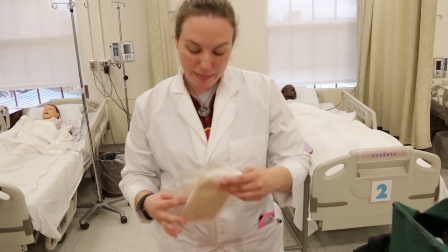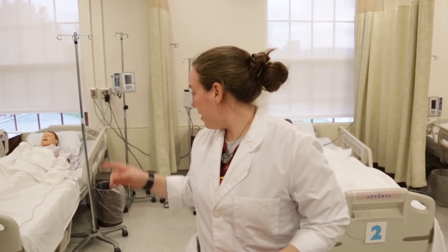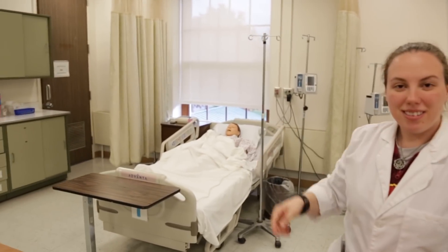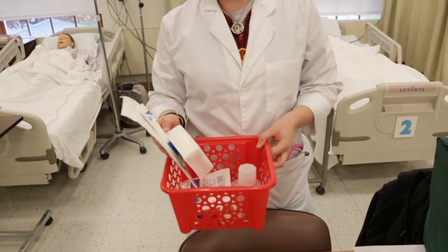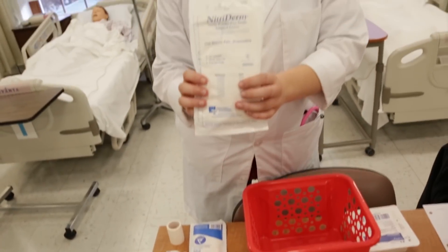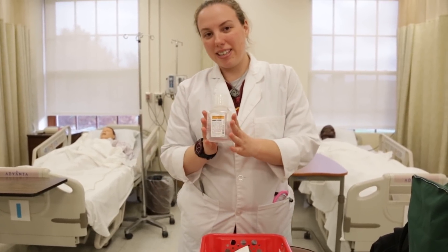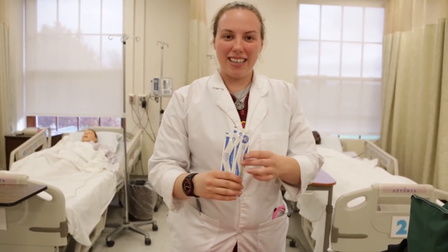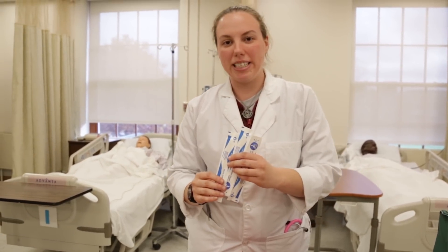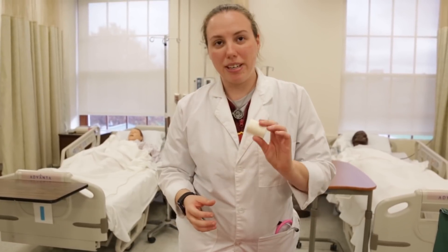I am combining all my dressing changes in order to change the wound dressing with normal saline from moist to dry. I have to collect everything I need before I go see the patient. I have surgical sterile gloves, the sponges that I'm going to be packing the wound with, the normal saline that will keep the wound moist, and the sterile cotton swabs to press the wound packing in. I also have the pad that goes over everything and the tape that will keep it down.